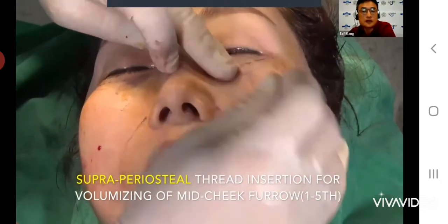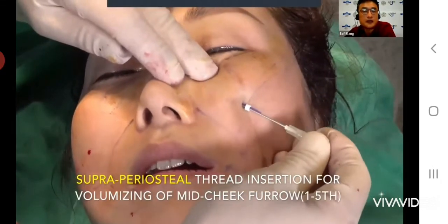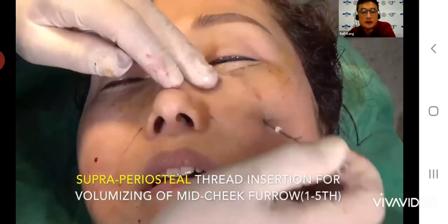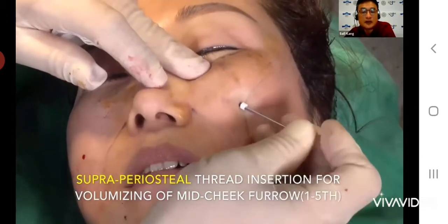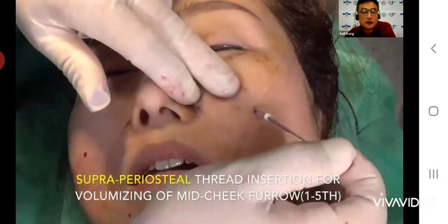You can control the number of threads from your finger feeling after touching. I don't recommend using only one entry site; use 2 or 3. It's no problem. Divide into 2 or 3, please.